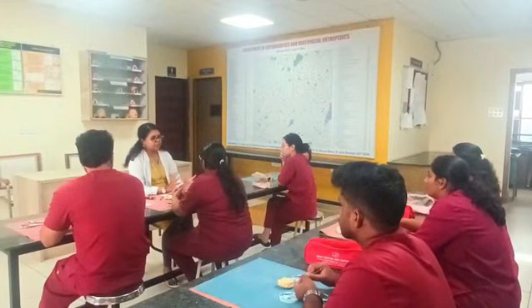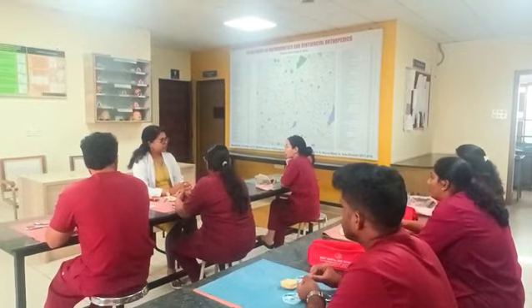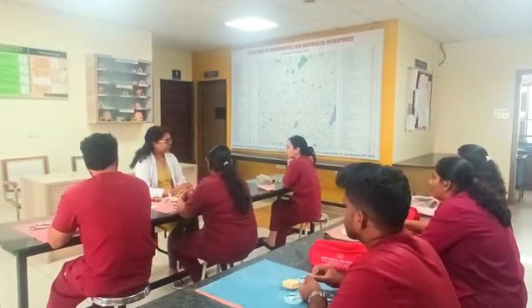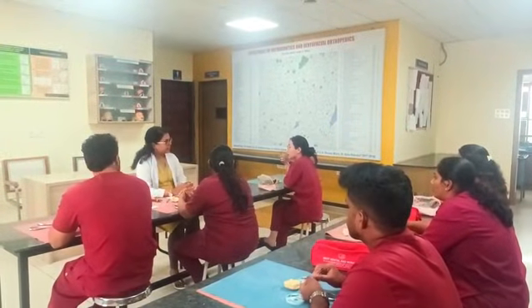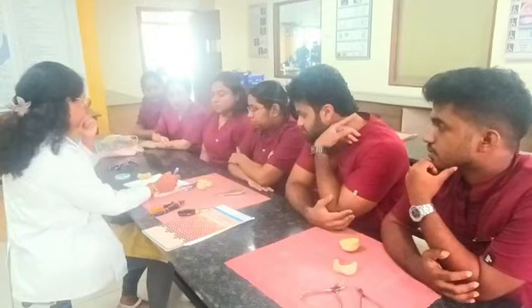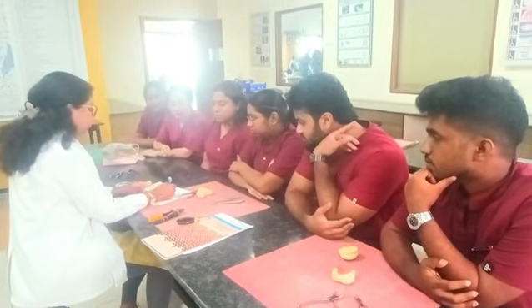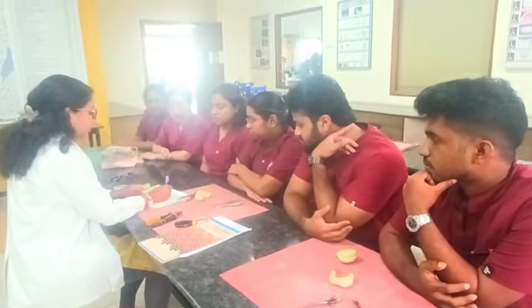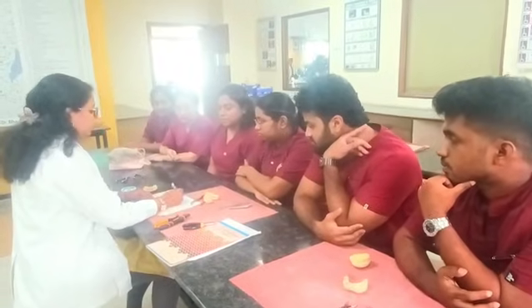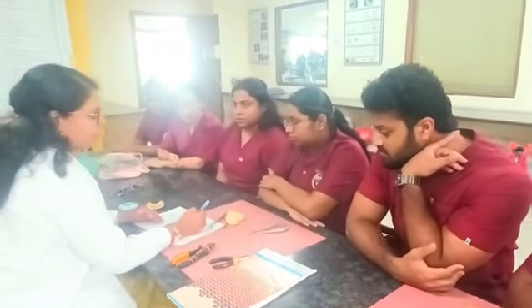Then, next, what is the advantage of the Adams clasp? Can anyone of you tell? Name any two advantages. It offers good retention and can be given in fabrication of orthodontic appliances. And we know the bridge is going to lie in the middle third when we divide the tooth into three parts. So what's the width of the bridge? It is going to be 2/3 of the mesiodistal width of the tooth.